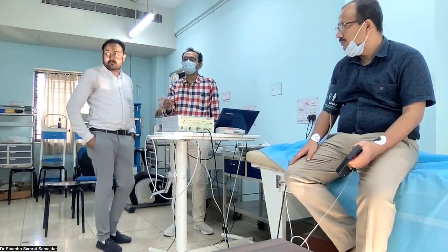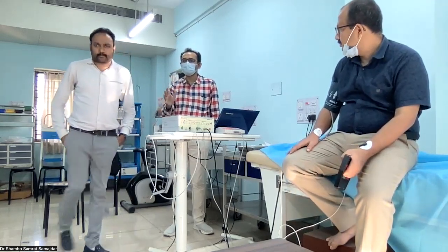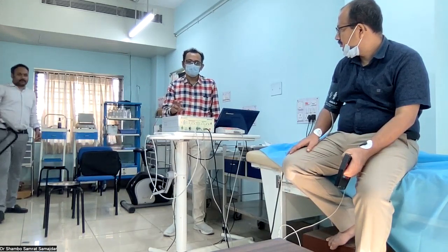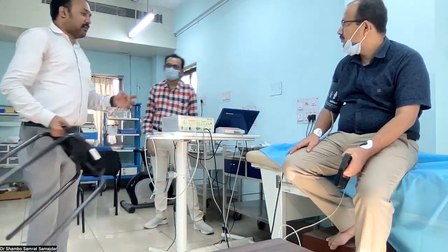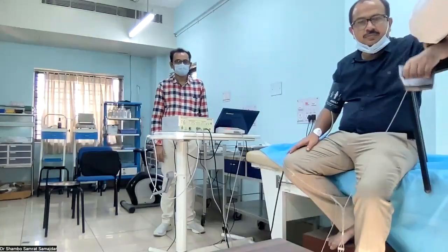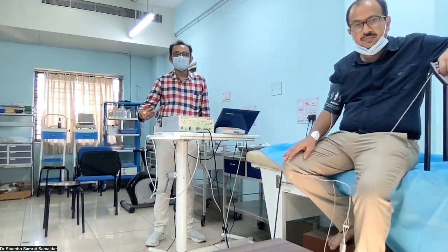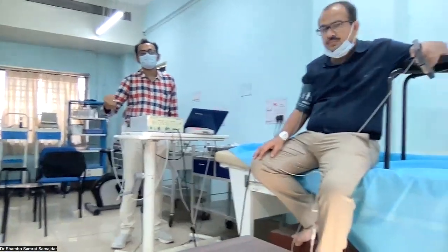Internationally, all the societies and physicians prefer this Ewing's protocol, but here we need to modify it a little, and we are using a modified version of the Ewing protocol to get the reports. So let's start. Also, while placing the bar, we have to give some support underneath the arm. It's very important. Otherwise the muscle fatigue will be more, and that could be enhanced if the hand does not get any support. So we should have proper support.